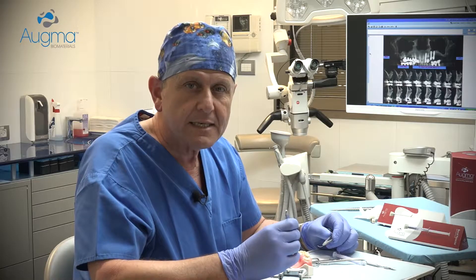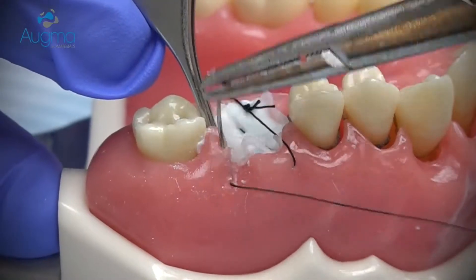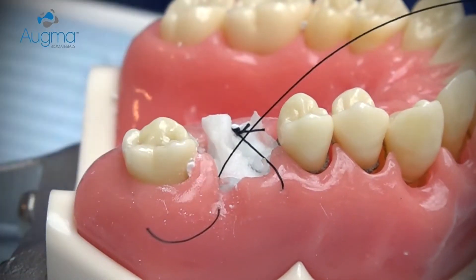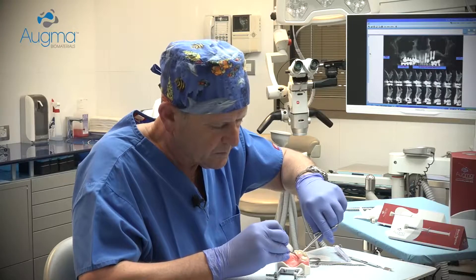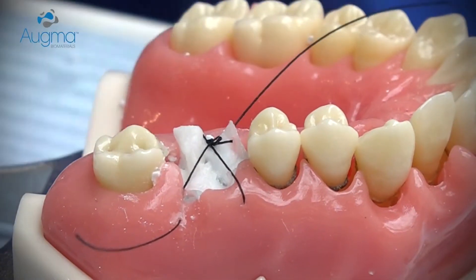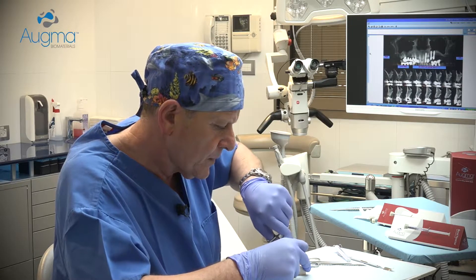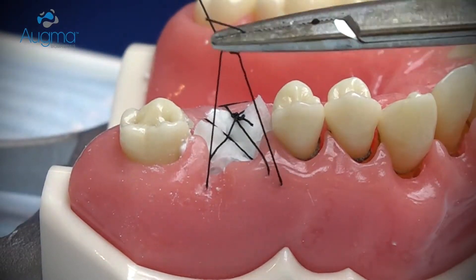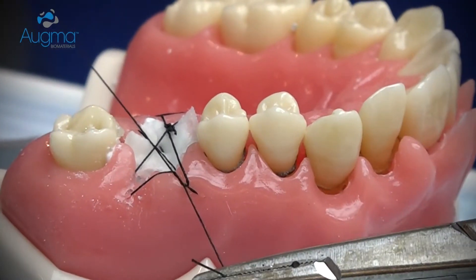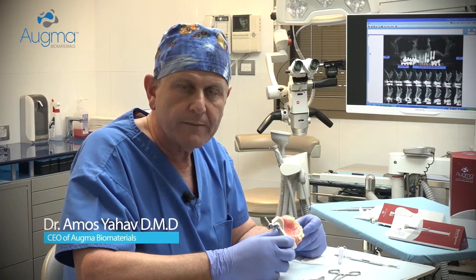After stabilizing the collagen sponge or membrane in place, you continue with a criss-cross suturing in order to protect it in a better way. Now the graft is protected and you can leave it exposed in that way.